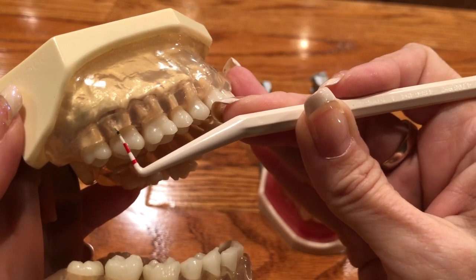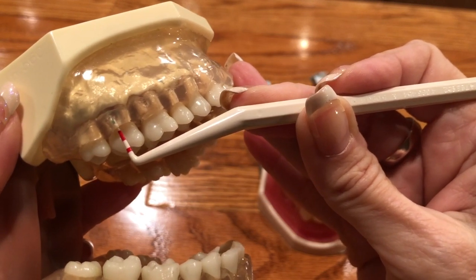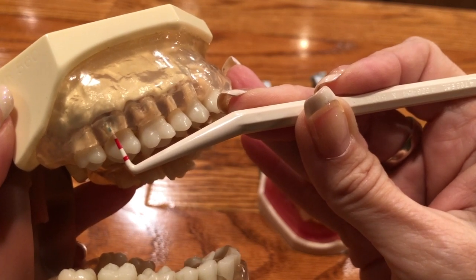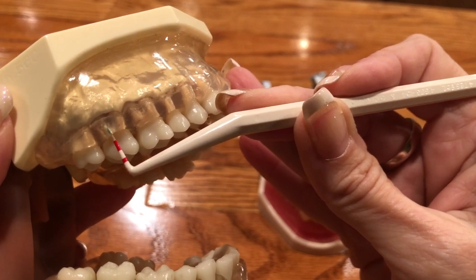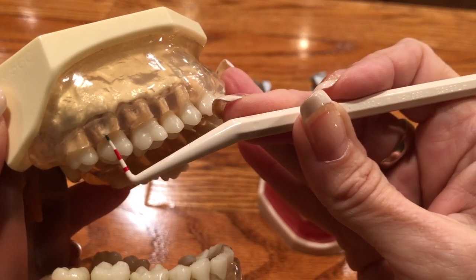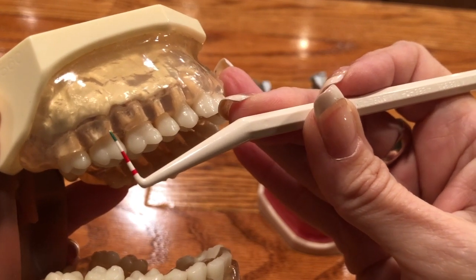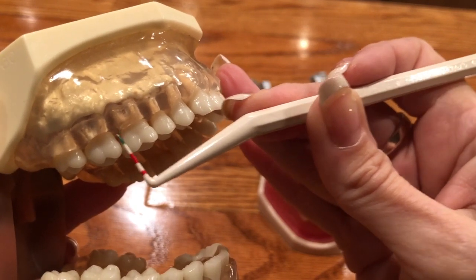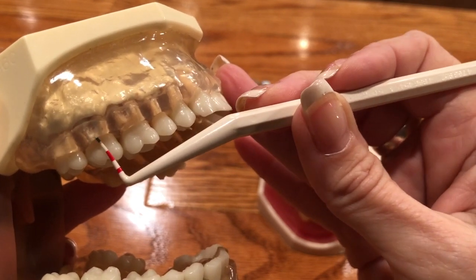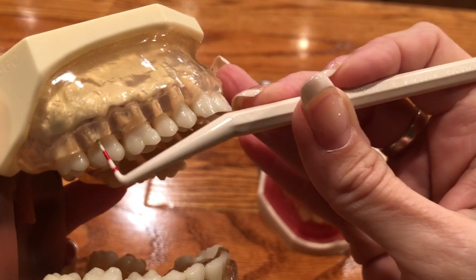3, walking around. Now I can push it down here to a 6. So you can see how far down this probe goes below the gums if this is a 6 millimeter pocket. It's almost impossible for you to get your toothbrush that far down below the gum line. So your toothbrush bristles can usually sweep about 3 millimeters down below the gums, which is why we like them to be 1, 2, and 3, because you can get in there and get the bacteria out. If the bacteria gets this far down below the gum line, it's almost impossible for you to get in there, and we need to get in there and scrape that out.